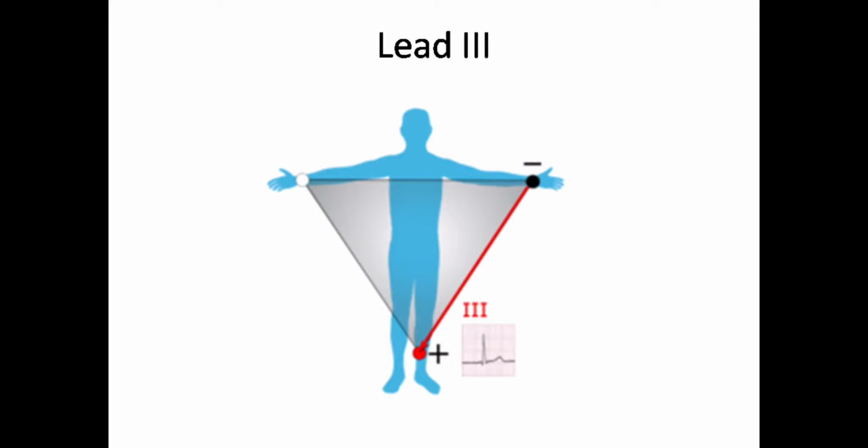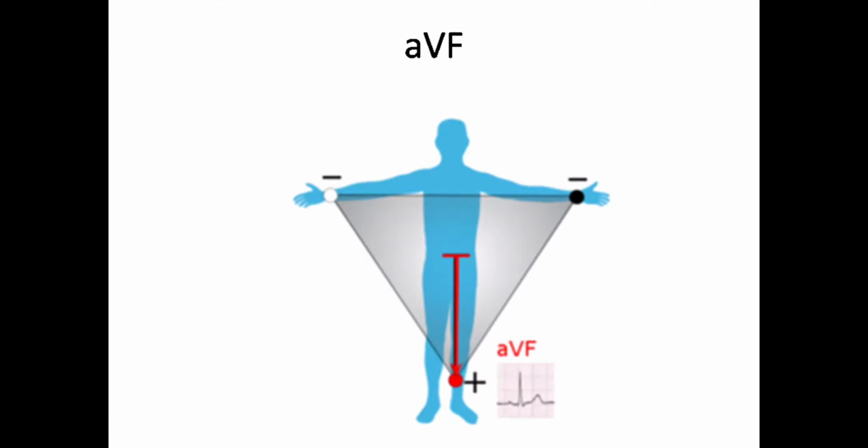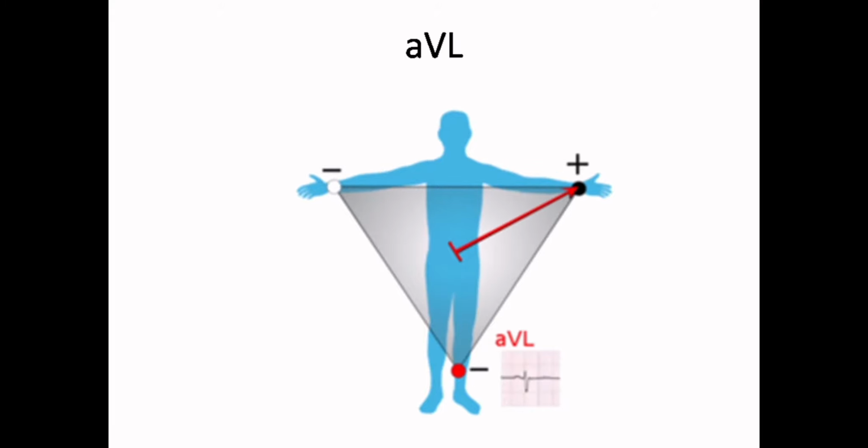Then there are some leads such as augmented unipolar leads, or augmented limb leads. The augmented lead of foot, AVF, is from the heart to the left leg.